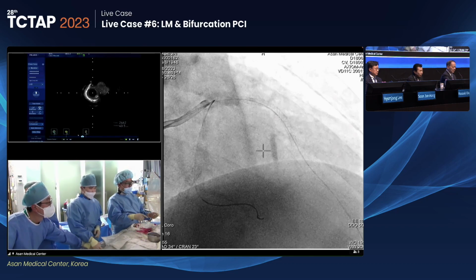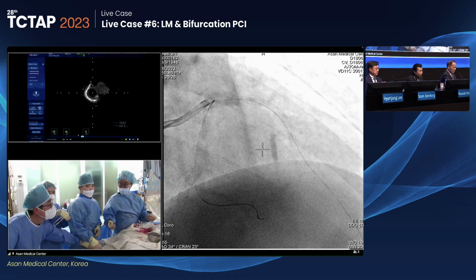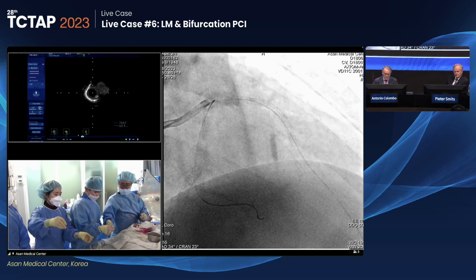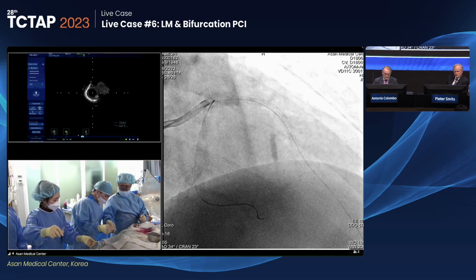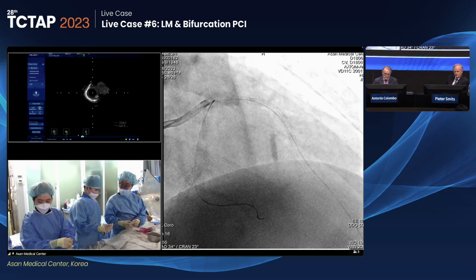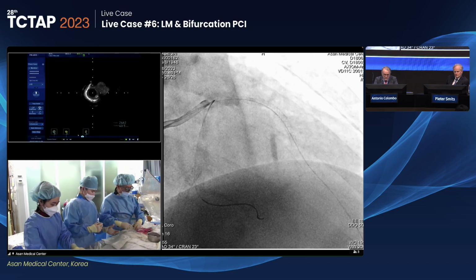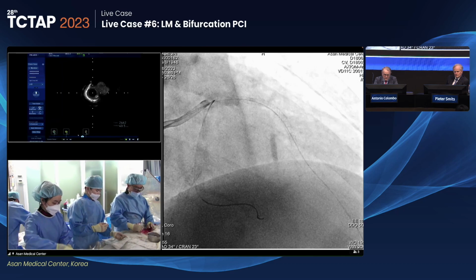So, we invited this session's father of DK Crush, Professor Shao-Liang Chen. Your comment would be very helpful. What is the difference between your DK Crush and our some balloon crushing? What is some important point we should consider during the crush technique?